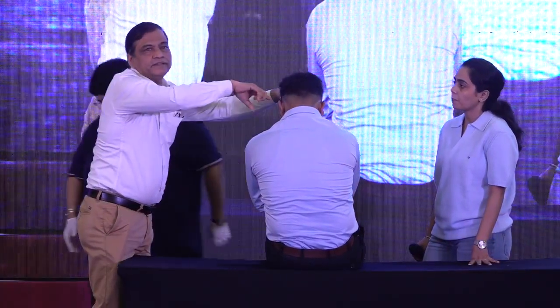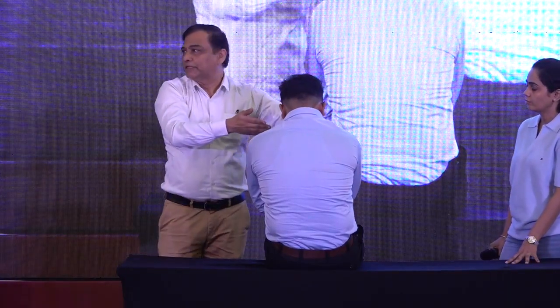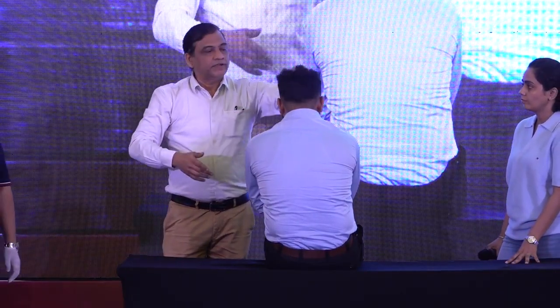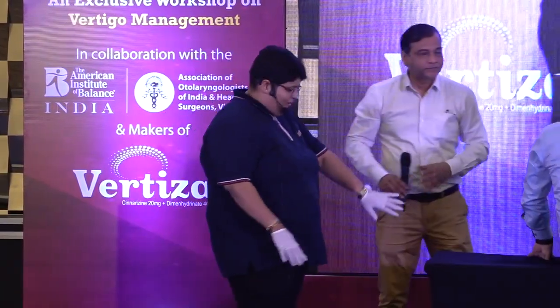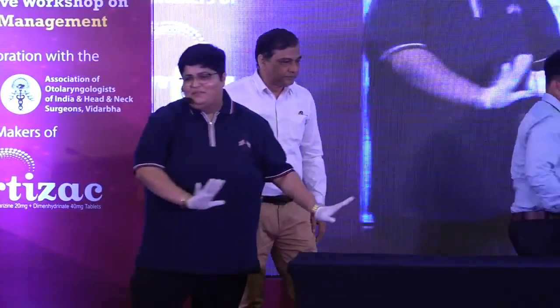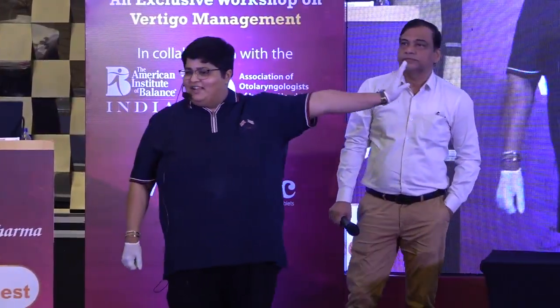This final step is a modification. Many people will skip this. And finally this is the one rotation. I will go for at least two Epley's in the first setting. So this is how you perform an Epley's maneuver. Sir has explained it very well. And now, we'll wait. So basically this is how you do the posterior canal assessment.